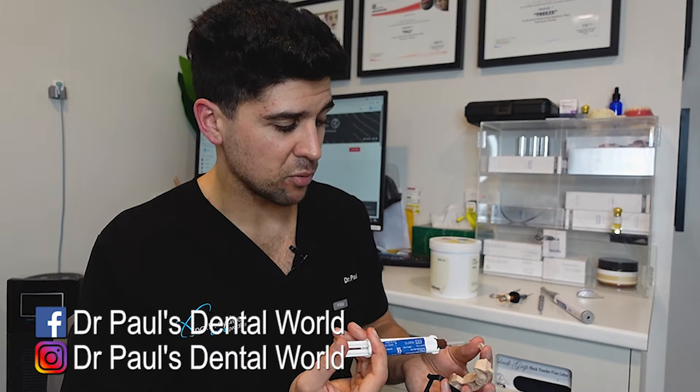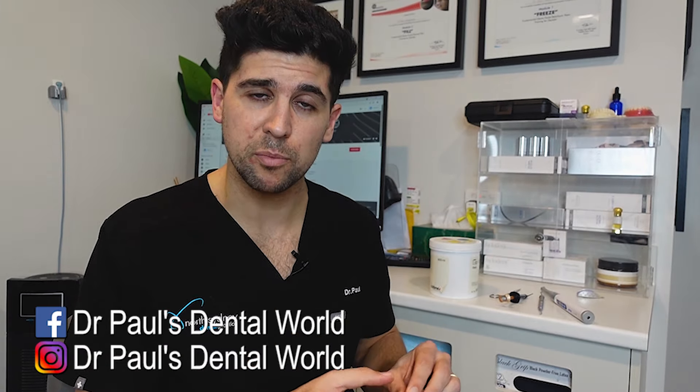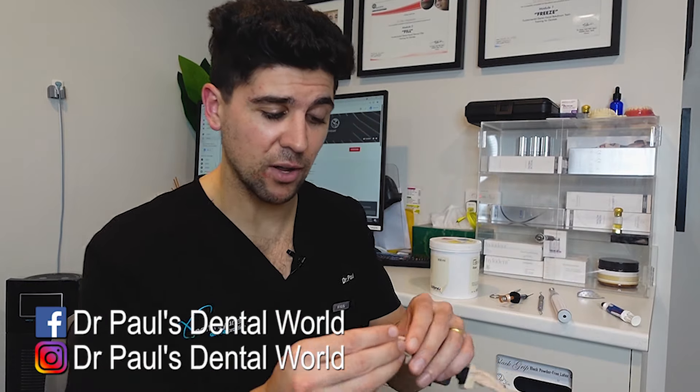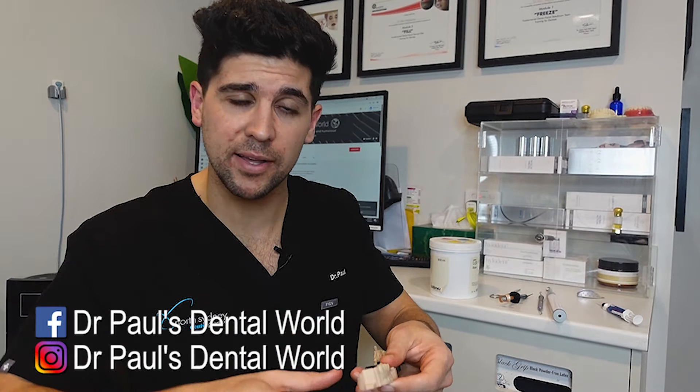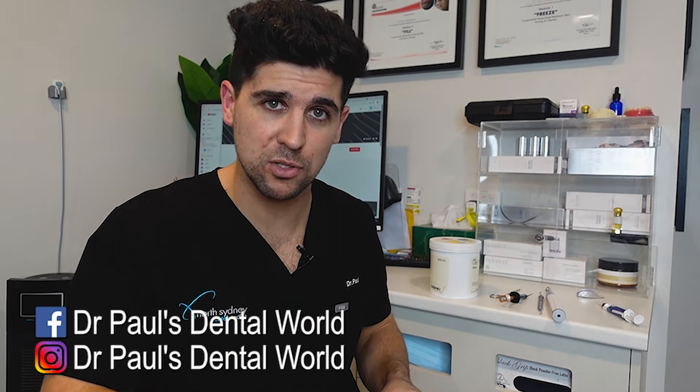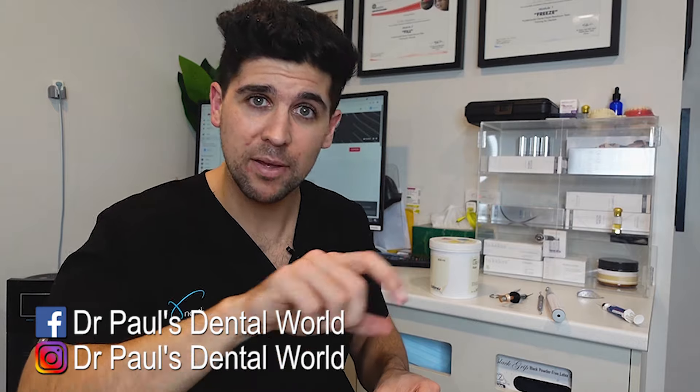So now it's time to cement it into place. Now if you just put some of your temporary cement in and plonked it on the tooth — because of how thick this is, the pressure that builds up doesn't actually allow a lot of it to ooze out of the side. So you'll find that when you push it down, you can't push it down as far as you normally would. So what that means is you get a gap at the margin and also it ends up being high in the occlusion.